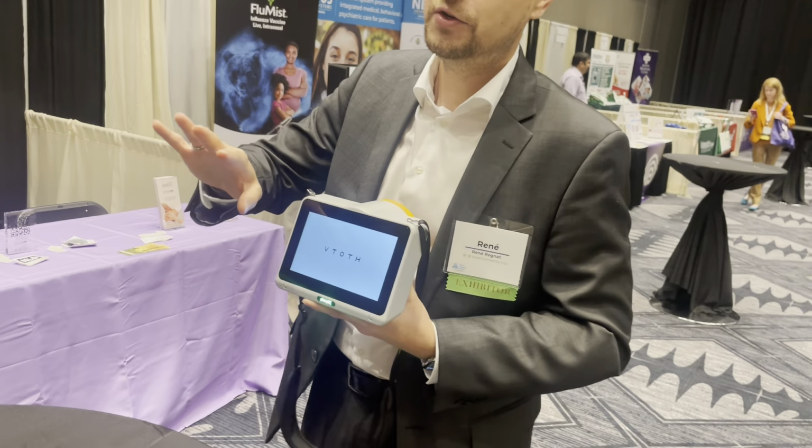This here is our red reflex mode. This is simply taking a picture and showing you the red reflex. This is great for babies or for patients where you don't want the refraction, but you want to check for cataracts, retinoblastoma, for example, scars.